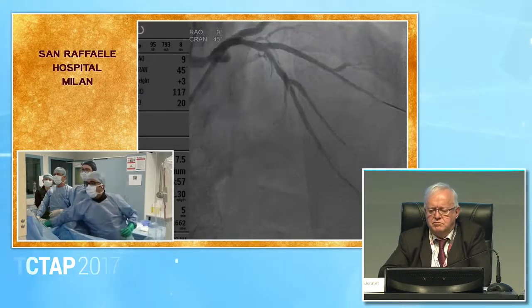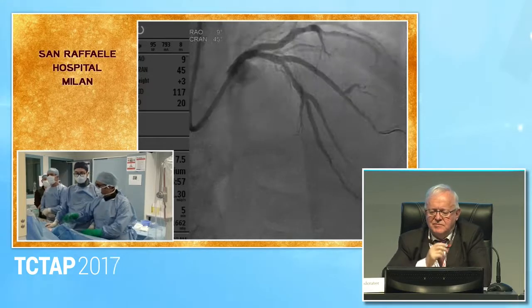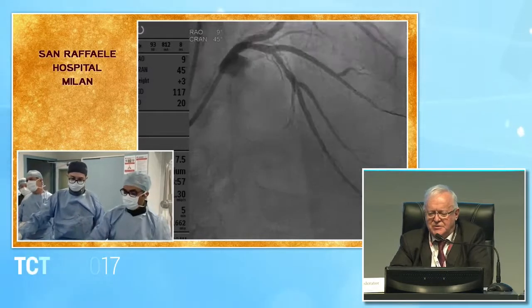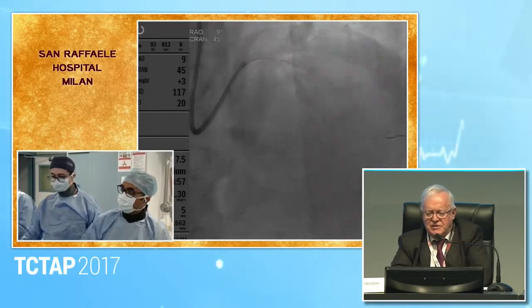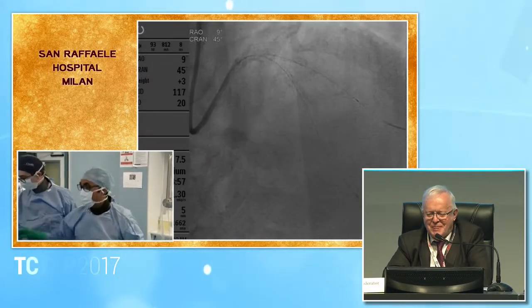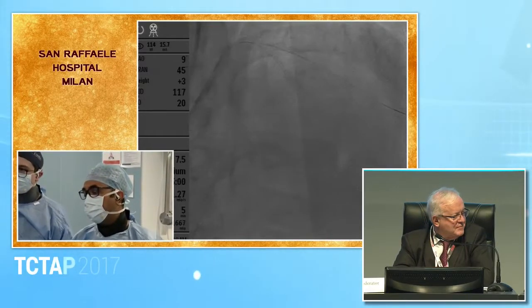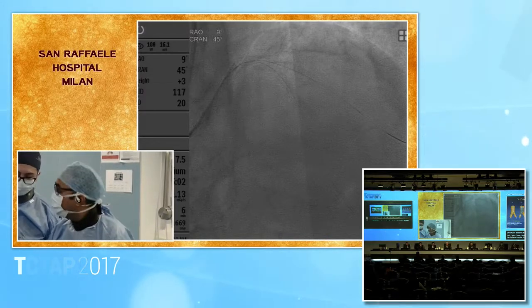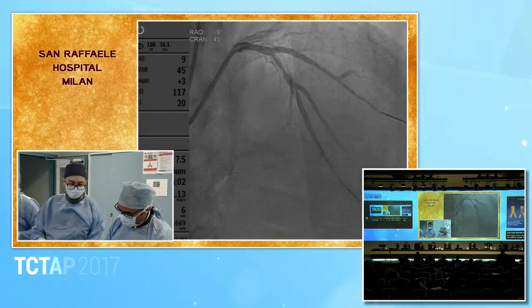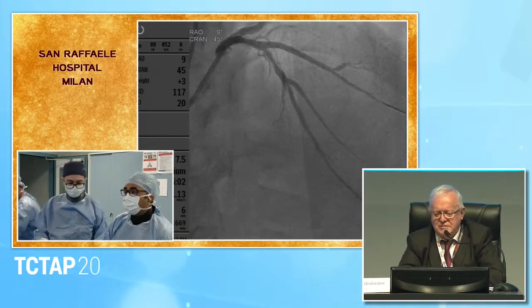So the two diagonals looked very good. What do you think about the LAD? Normally in my place we are not rich enough to have IVUS, but you have an IVUS, so we can look at the IVUS because you have it. So. Let's do an IVUS. I agree. Yeah? Yeah, because it's in-stent stenosis in the LAD, maybe you can try the DCB. Have a little image, with a drug-coated balloon. Yeah, that's the discussion. Okay. Either doing a long dilating balloon or putting the stent.